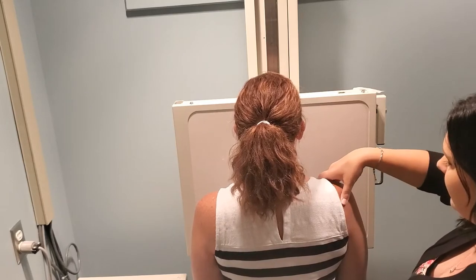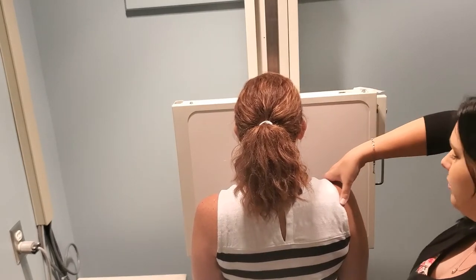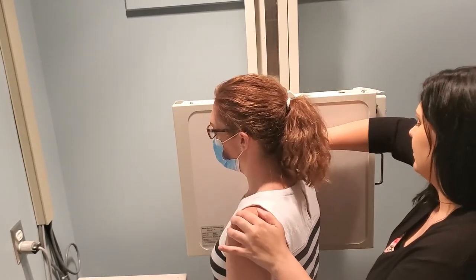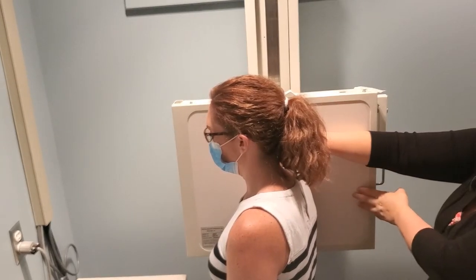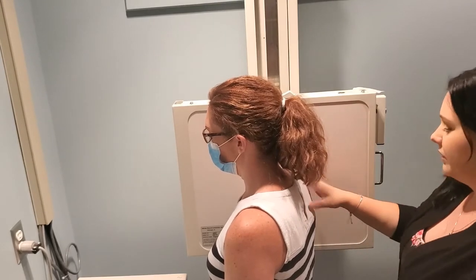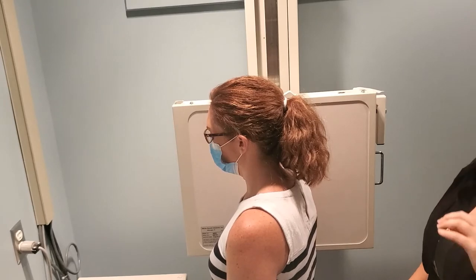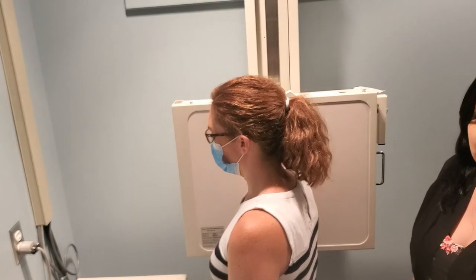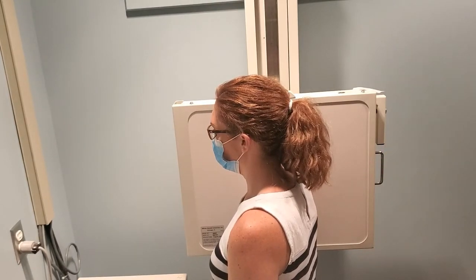First, take the humeral head — make a cup with your hand and cup that humeral head, turning the patient so it's directly in the center of your bucky, because that's where your cassette is. From there, you can either put the hand on the abdomen or rest it at the patient's side. Personally, having the arm resting at the side makes it more likely for the scapula to align with the humeral body really well.